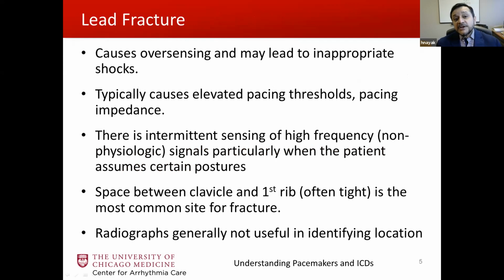Now, remember that lead fractures cause oversensing of noise, and that may lead to inappropriate shocks. Dr. Singh had a wonderful case where it can not only lead to an inappropriate shock, but also inhibit pacing. So in someone who is pacemaker dependent, the patient suffers a sort of double whammy. They can get a shock, and then they can also have asystole.